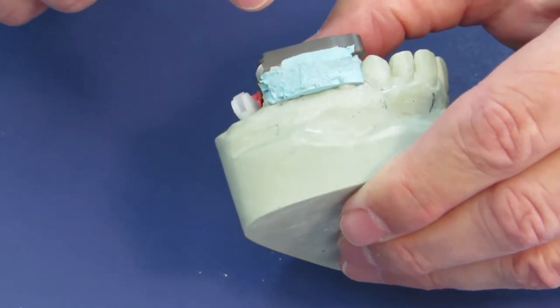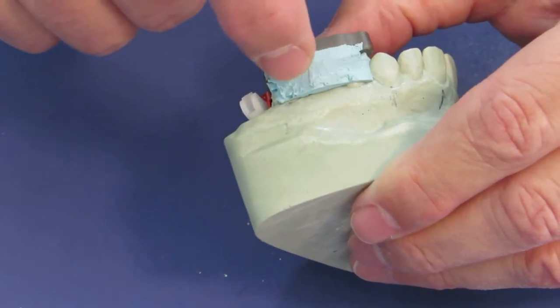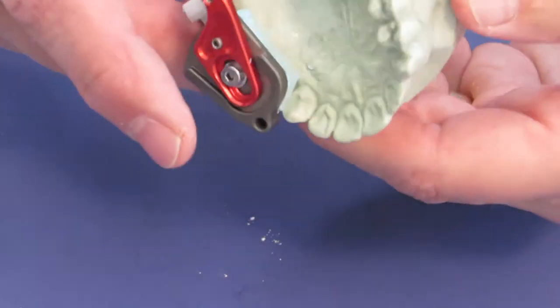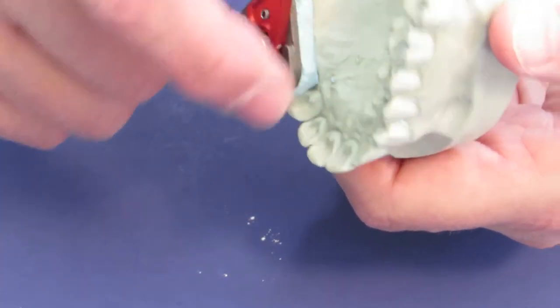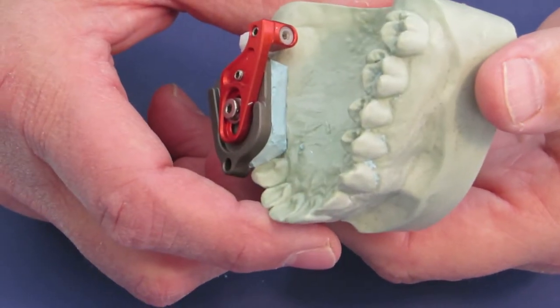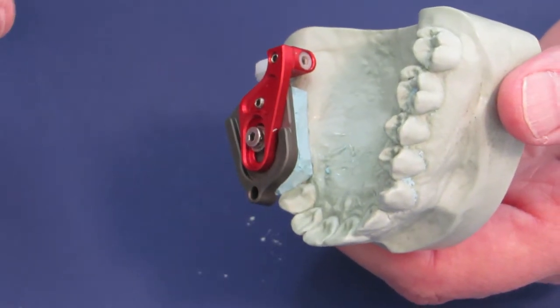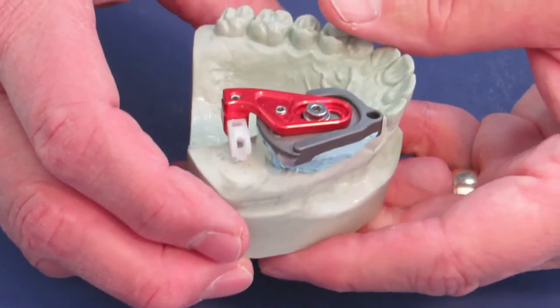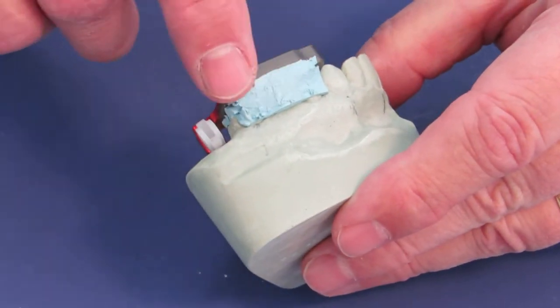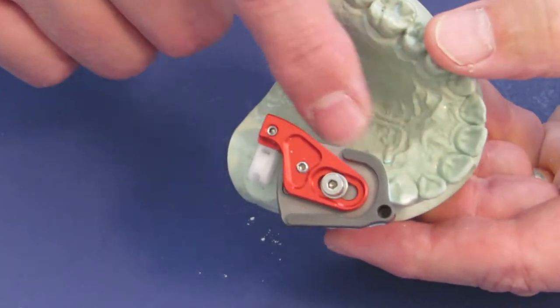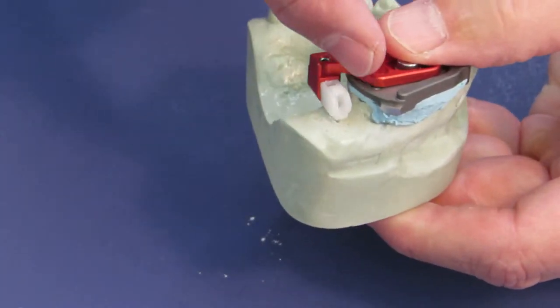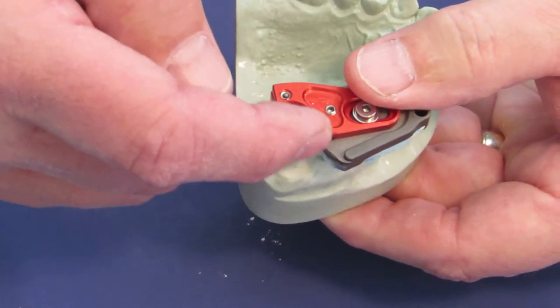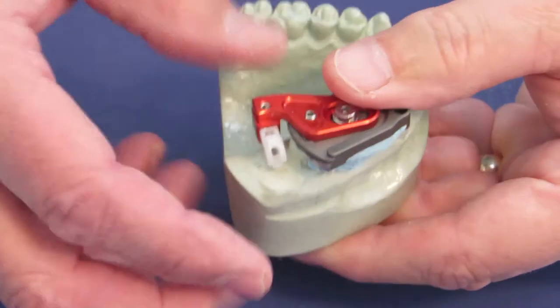Sometimes I add a little bit of extra bite paste here on the buccal or on the lingual side to give it a lot of grasp and security. After that hardens I can take a burred parker and just clean off any excess so that it is easier and make sure that there is no paste here where the arm is going to swing.